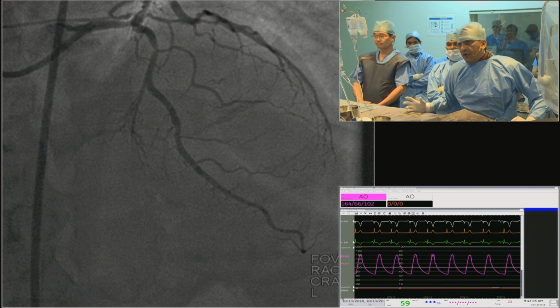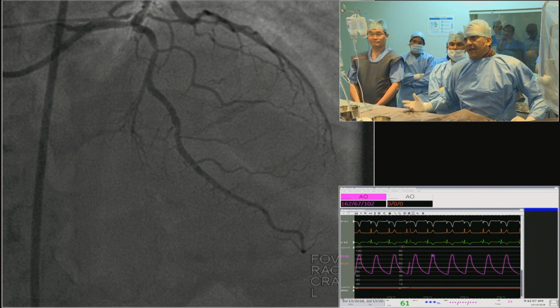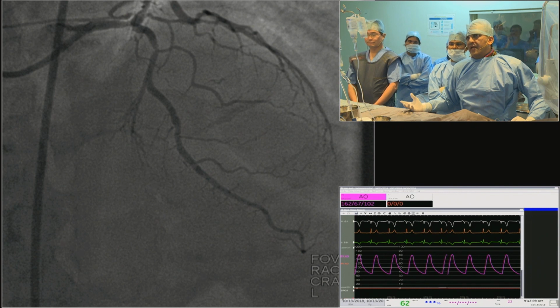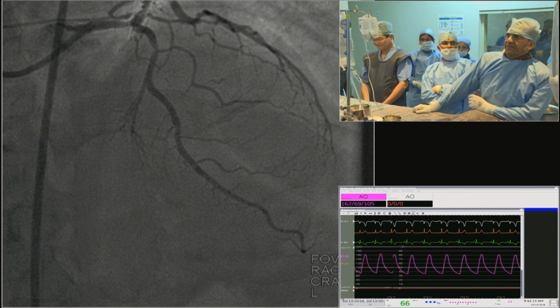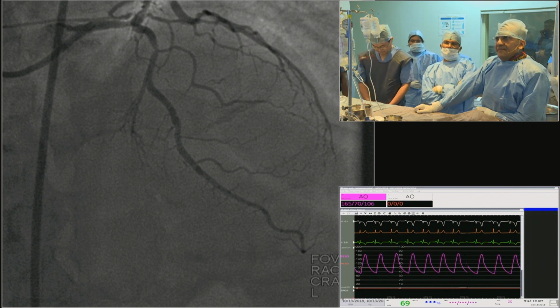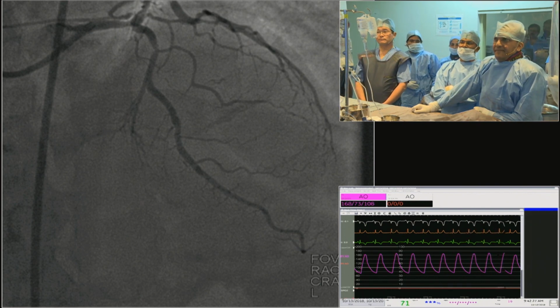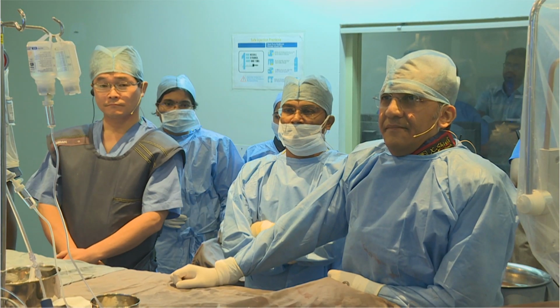Does anybody in the audience think that we should just consider this left main to be significant and not worry about any imaging or physiological assessment? Hi, Kirti, this is Nick Parchura here. Hi, Nick. Adjudication of the lesion of left main cannot be based on angiography alone. Excellent. That's very clear, simple and straightforward. Okay. It's wrong in 50% of the times.